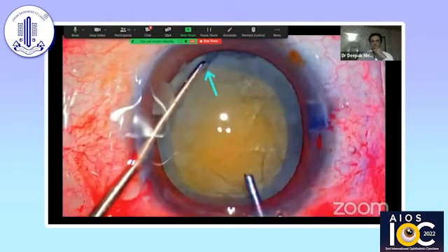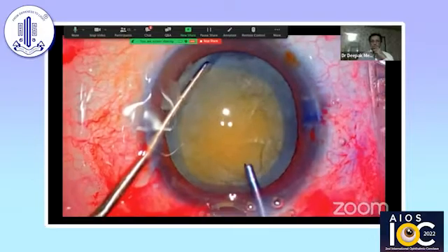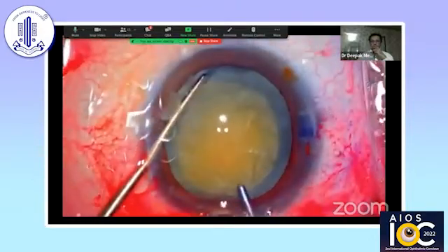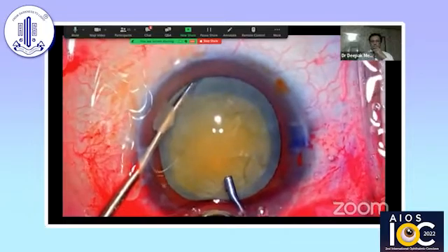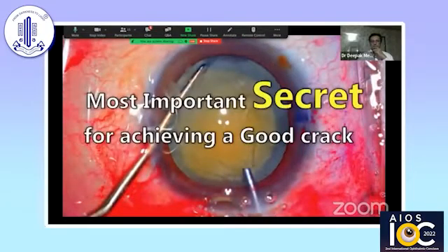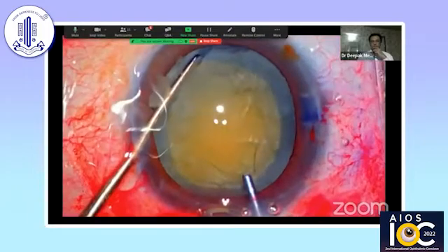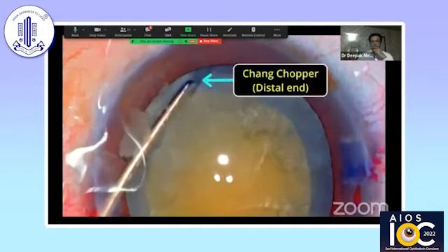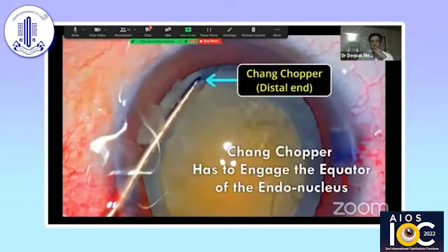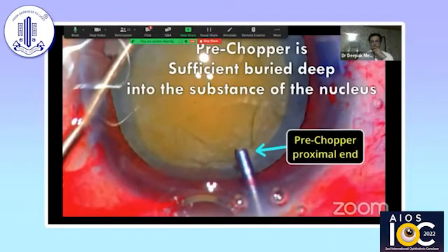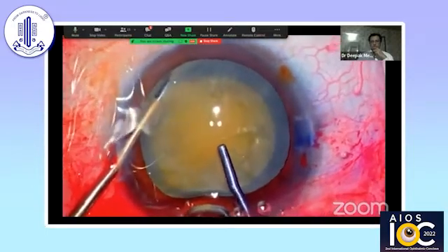We can see the tenting of the anterior capsule, confirming the chopper is under the capsule and not above it. Now with the pre-chopper placed at the proximal end just beside the rhexis margin, the key thing is that it has to be buried sufficiently deep. The most important secret of achieving a good crack without inducing any torque — especially in dense nuclei — is that both instruments, the chopper at the distal end and the pre-chopper at the proximal end, must engage a sufficient part of the nucleus. The Chang chopper has to engage the entire equator of the endonucleus, and the pre-chopper has to be sufficiently buried deep into the substance of the nucleus.